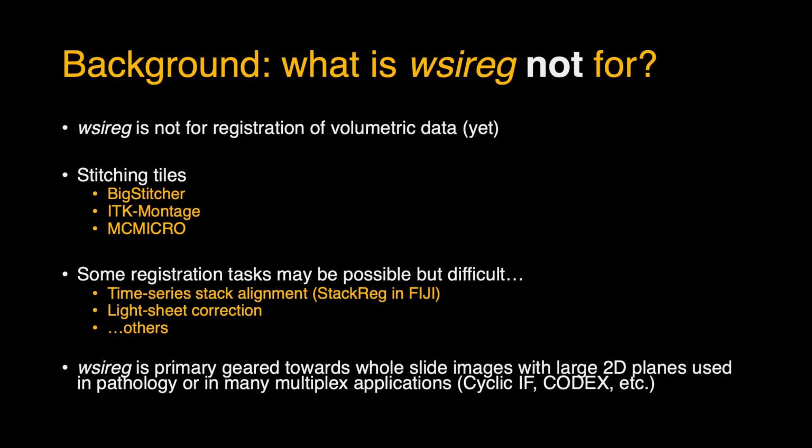So it may be possible, if you found wsireg very useful for your work, that we could collaborate on that and develop that. And so wsireg is primarily geared towards whole slide images with large 2D planes used in pathology or other applications. We use this a lot in our lab for CODEX or cyclic immunofluorescence, but also for combining just any sort of modalities across multiple sections or within a single section, so sequential stains.